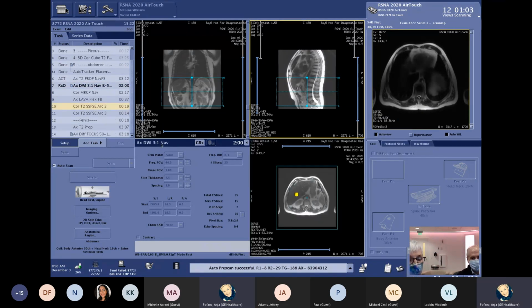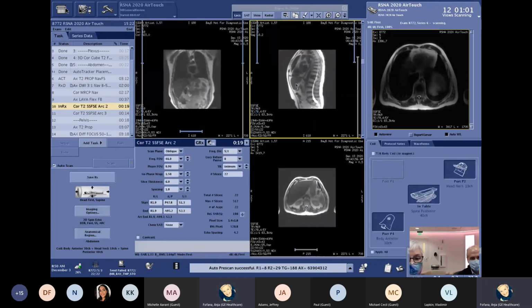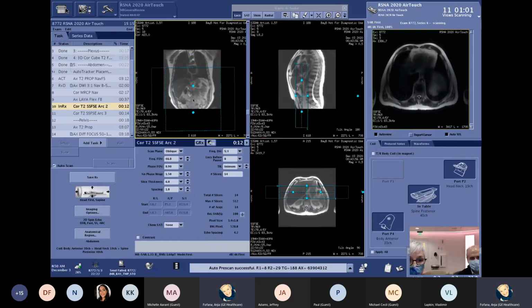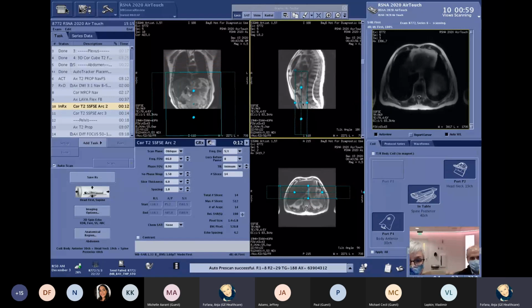Okay, and then we just show you an image and how nice the coverage is with the air coils. So I'm just going ahead and we'll do a single shot sequence in breath hold, and we will cover all the way from the liver down to his pelvis just in one scan.